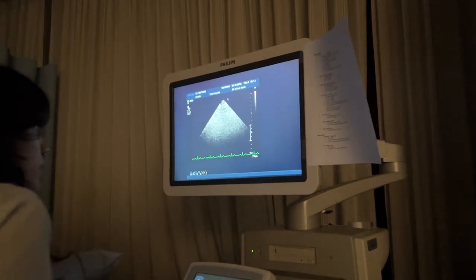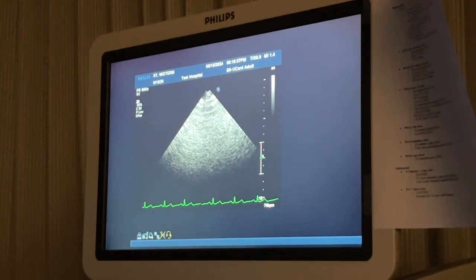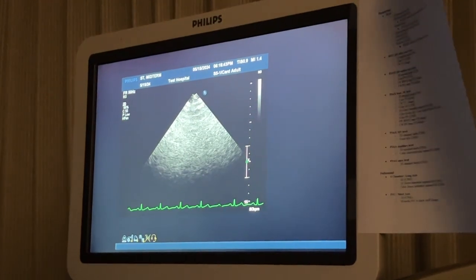Just finished doing this week, so if you don't mind, I will go through the imaging without describing where the indicator is and all that, because you all know by now. We probably won't talk a ton about his actual valve anatomy yet, because I'll just get through the midterm protocol. We'll finish the videos.